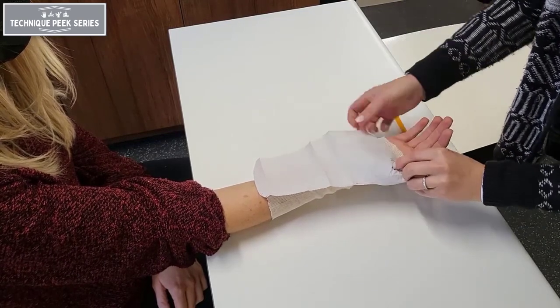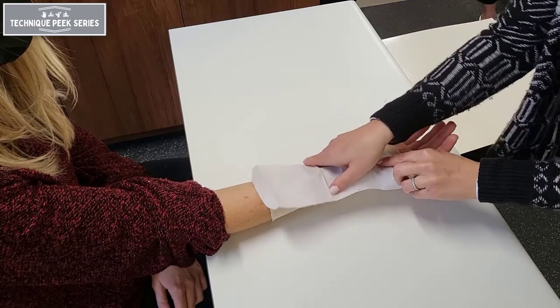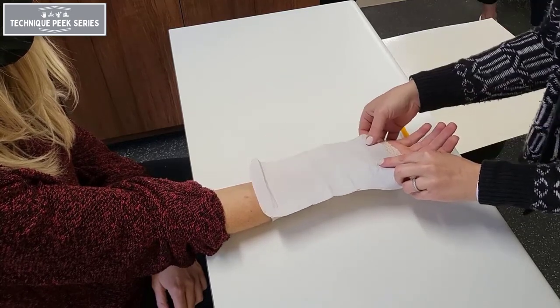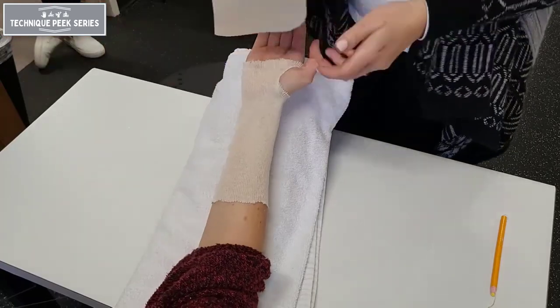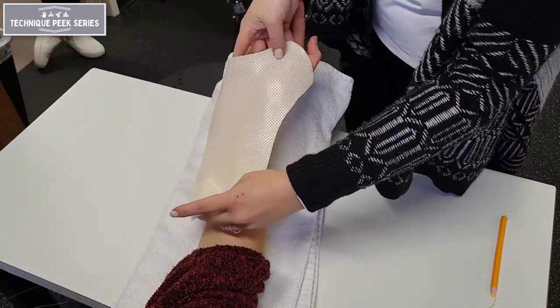Make sure that the IP joint of the thumb is free to move and that the distal palmar crease is clear. For greater ease with molding the splint, place your patient in a palm-up position — this will allow gravity to assist.